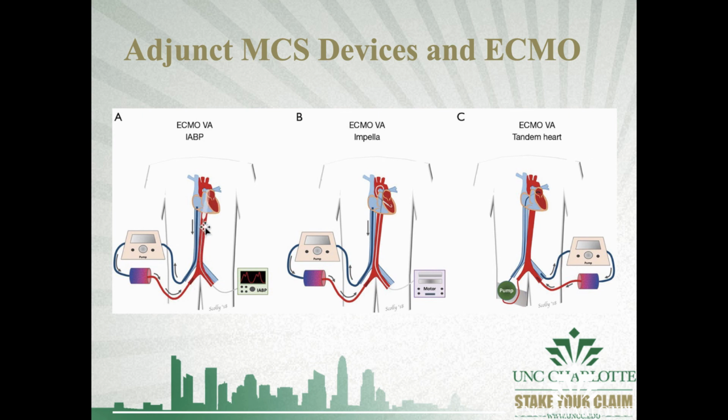We have this retrograde flow, so blood's building back behind it. And then we're also having better perfusion to our coronaries here. This will release during systole, and you'll have your antegrade blood flow here. So you have your reduction of afterload coming out here, and you'll actually reduce your mixing cloud to this area if there is one. So the balloon pump kind of gives your heart a little bit more rest and reduces that LV distension, and you might see this in your hospital as well.